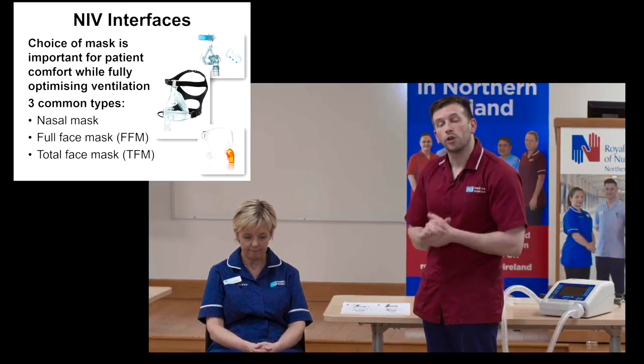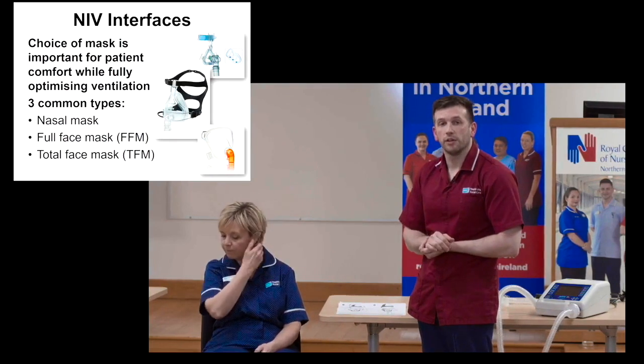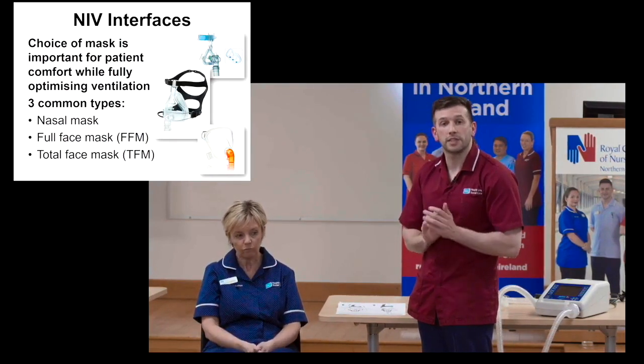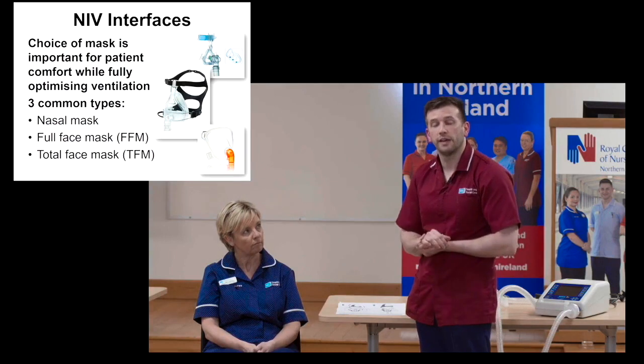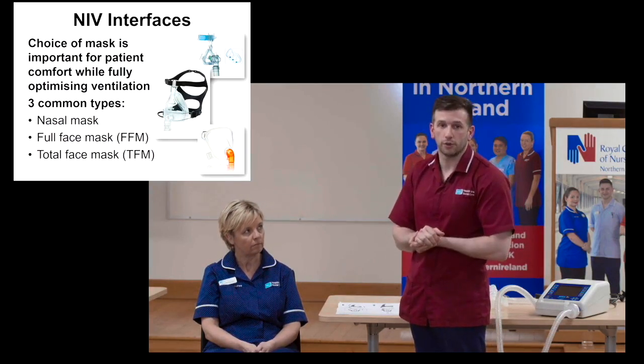ventilation. We're going to use the approach of mask on, then ventilator on. For removal of the mask, it will then be ventilator off and then mask off. We feel that this is the easiest way to apply the interface to your patient.